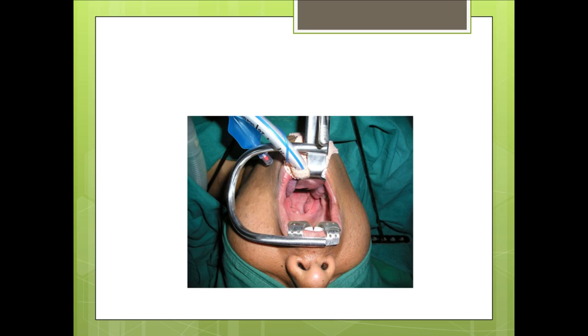Roll number 7, are you seeing any instrument? What is that surgery? Is it adenoidectomy, sir? Tonsillectomy.